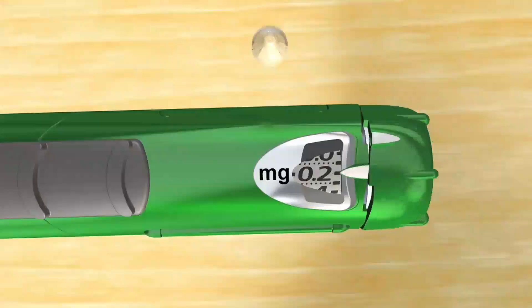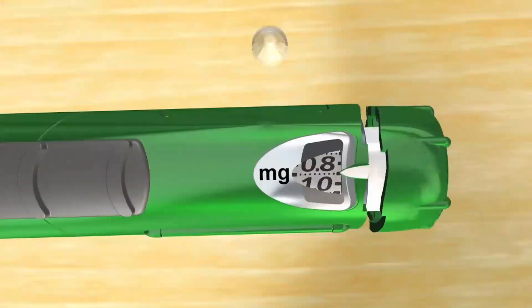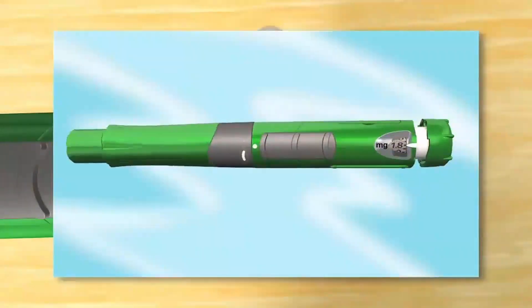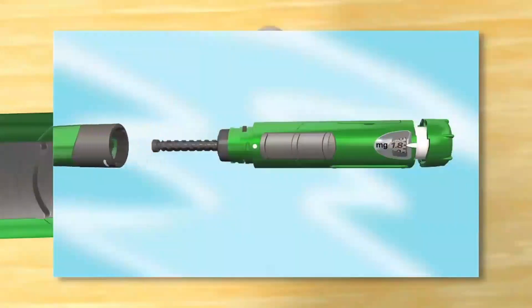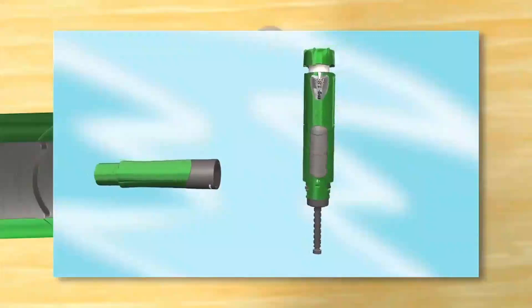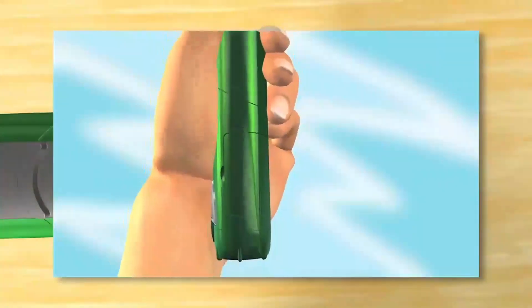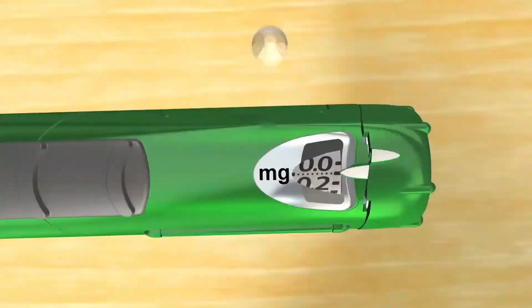Gently turn the dose loading knob at the end of your SurePal until you feel resistance — this means you've reached your preset dose. Be careful not to force the dose knob beyond the point of resistance. Check the dose window to make sure the right dose is loaded. If the dose in the window is not right, take the locking ring with preassembled cartridge off your SurePal. When the locking ring is removed, push the sliding button and the dose will reset. If necessary, reset your memory dose to the correct dose and twist the dose knob again to the correct dose.